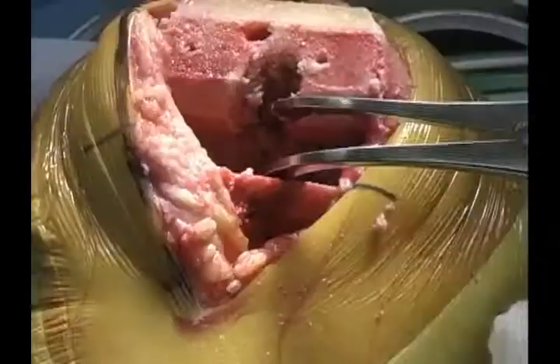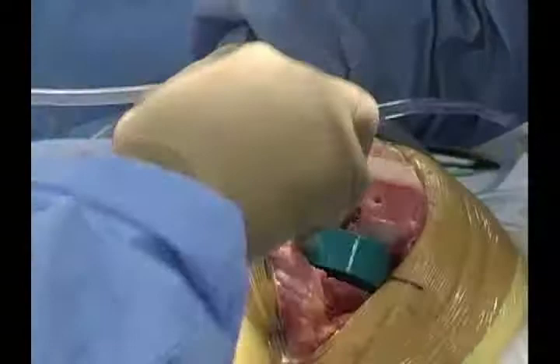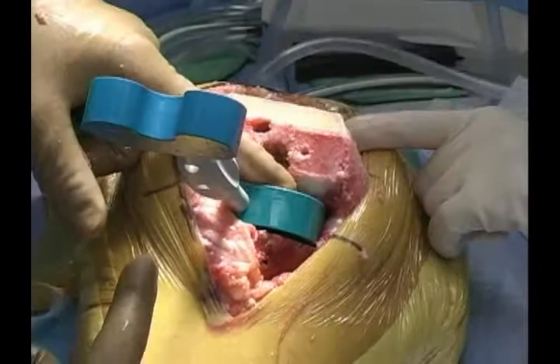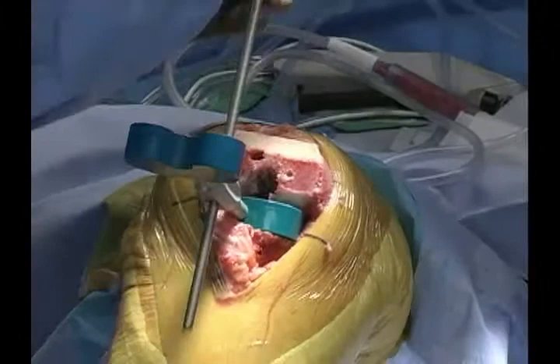If you're interested, you can assess the flexion space for a 10-millimeter insert. The spacer blocks have one end for the flexion space and one end for the extension space, so make sure the flexion space portion is in the flexion space. We can also drop a rod down to make sure our resection is where we want it to be — as you can see, we're right down the center of the tibial crest.